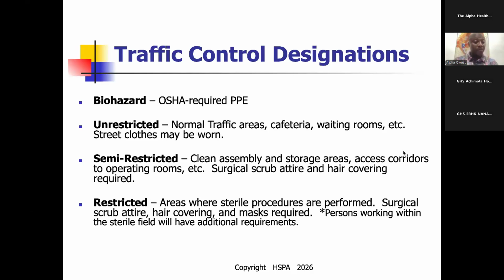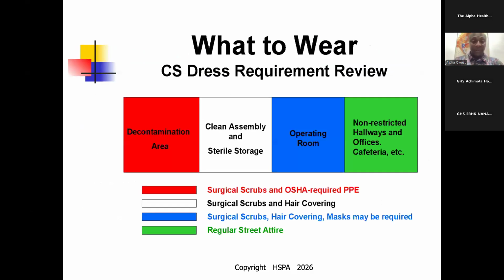Surgical scrub, surgical scrub. I'm repeating this because I saw things that I did not like. With surgical scrubs, we were not in compliance. Hair covering and masks are required. Persons working within the sterile field have additional requirements. Very, very important. What to wear in this area? The central sterile dress requirement review.